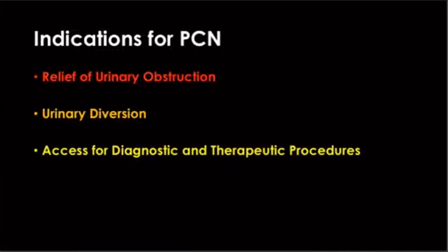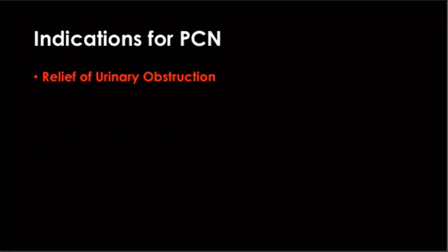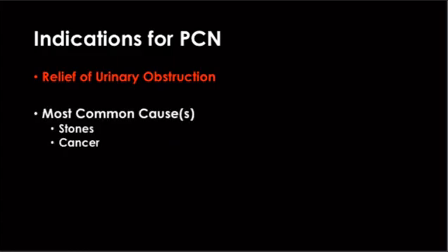So why do you do percutaneous nephrostomy? So there's basically three indications, okay? Relief of urinary obstruction, urinary diversion, and an access for a therapeutic procedure or diagnostic procedure. So when I say relief of urinary obstruction, what I'm talking about is stones and cancer.